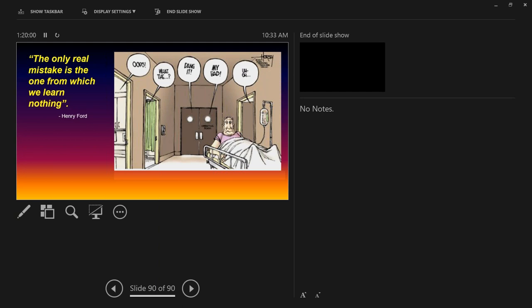Yeah, so that goes back to what we started with. They latched on to that. The hospital often builds a case of management problems before you ship or send anything to the manufacturer. They may have used that very information to try to use it against you. But that's where the medical device reporting network comes in. Through that research, you can maybe find where the same thing has happened. If you can bring that in along with your own records, you've got a much bigger chance of defending yourself. It's unfortunate that so much of that information is hidden and protected like that. That's precisely the kind of stuff people should know about so they can fix this stuff. It's the liability, the fears, the suits.